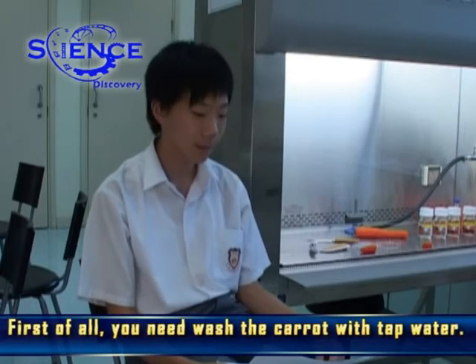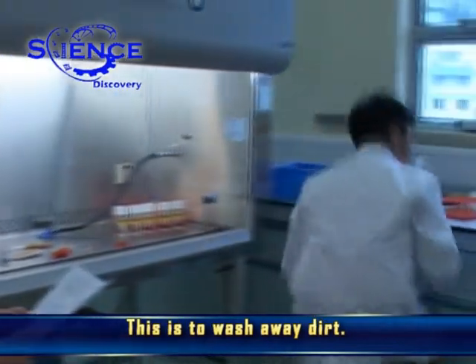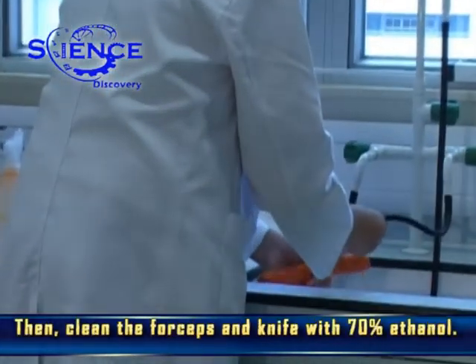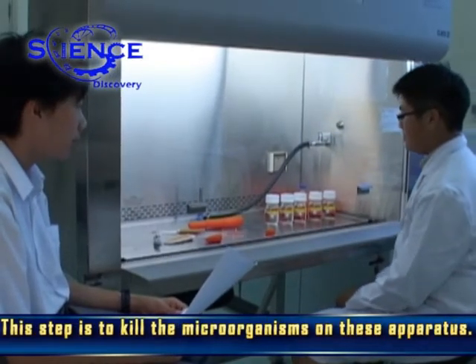First of all, you need to wash the carrot with tap water. This is to wash away dirt. Then, clean the forceps and knife with 70% ethanol. This step is to kill the microorganisms on these apparatuses.